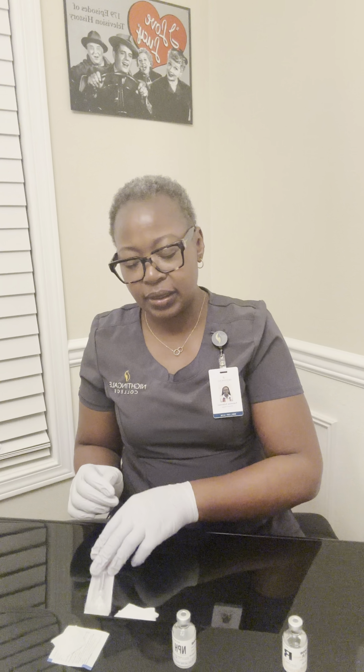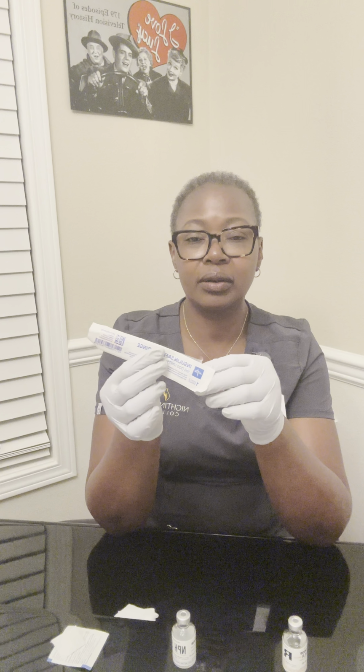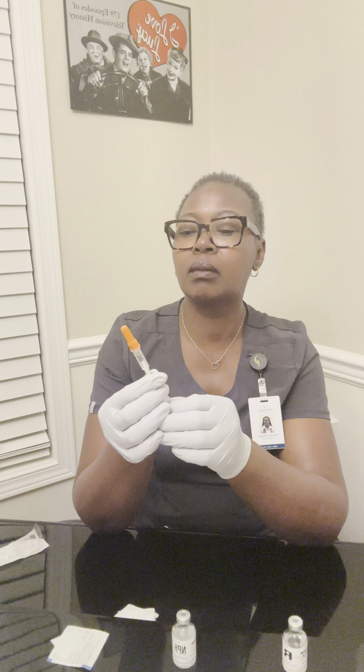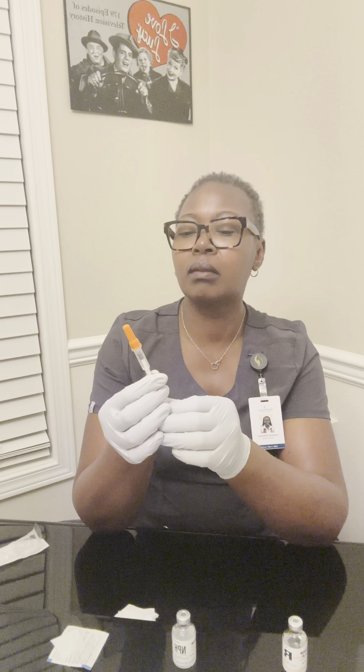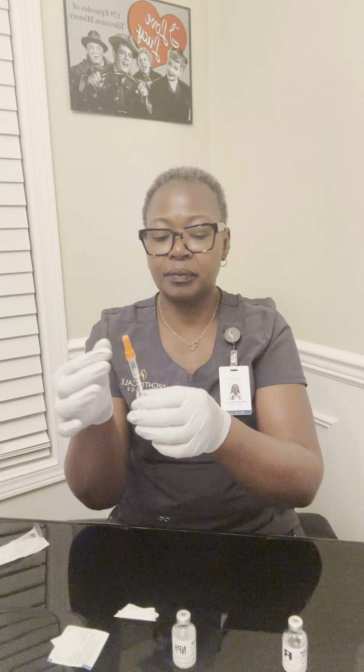Then with the 1 ml syringe, I'll go ahead and draw 8 units of air, and that I'll use on the intermediate acting insulin.